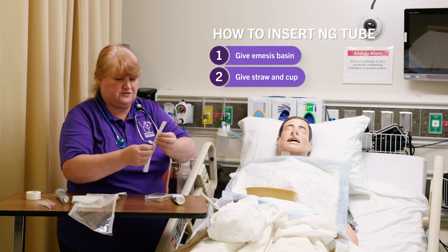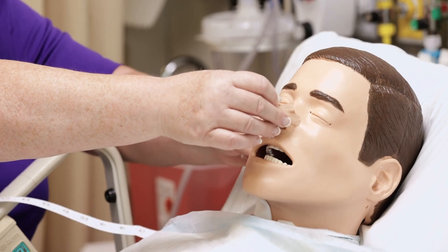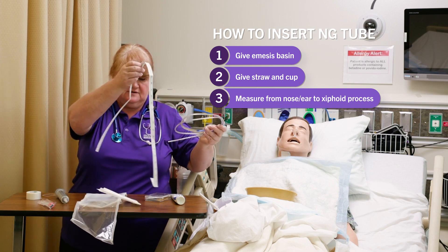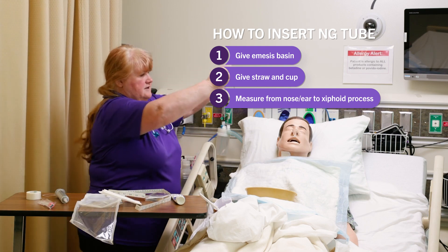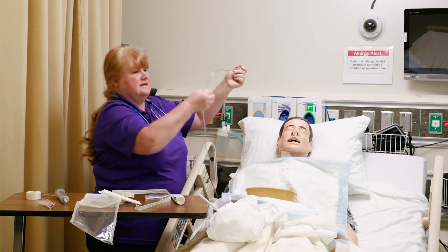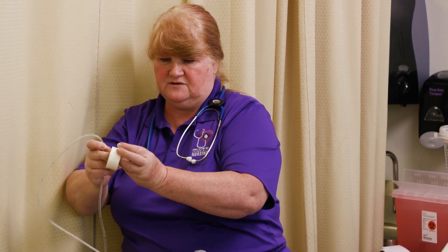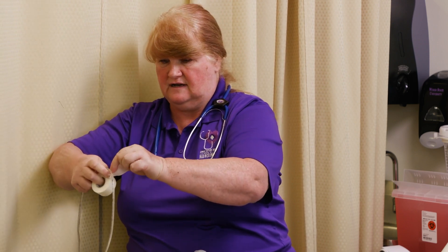We are going to measure from the nose to the earlobe, and down to the xiphoid process — that is 21 inches. You can do it with the measuring tape or you can do it with the tube, going from the nose to the ear to the xiphoid process. Then you can put a piece of tape or mark it. If it has numbers on it, like this one does, you can note that it is at 51. Some don't have the markings, so you can just tape it so you'll know when you've gotten there.